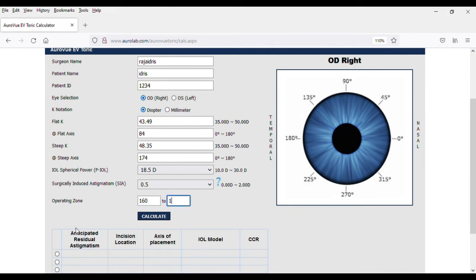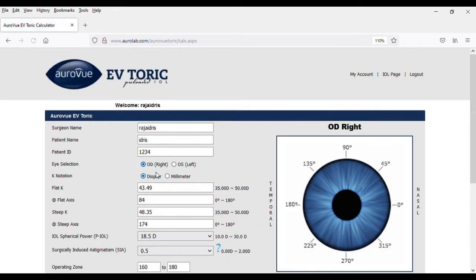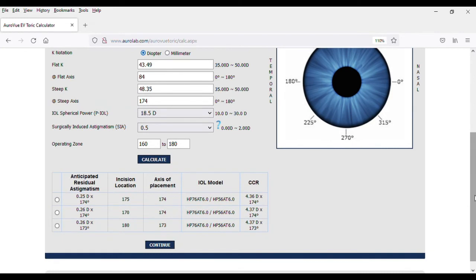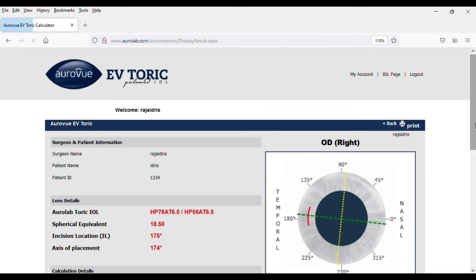Once all the particulars have been filled, click Calculate. The calculator will provide three best readings that give out the best possible anticipated residual astigmatism based on the incision location and cylindrical power. Based on the selection, check the circle and click Continue.